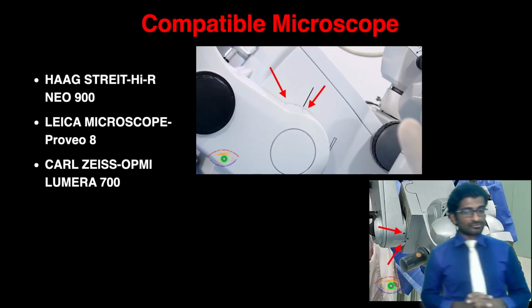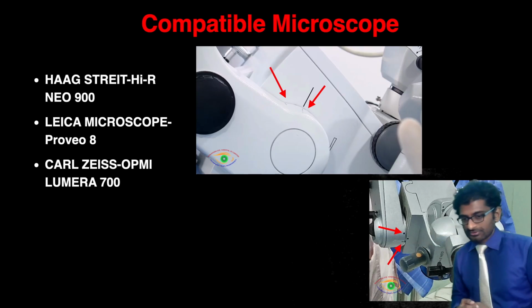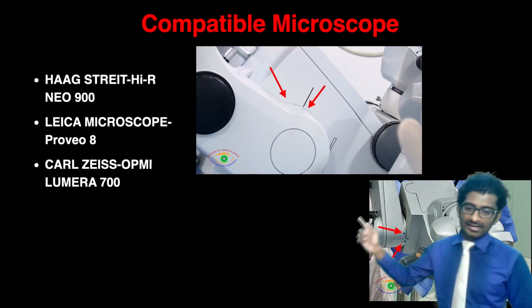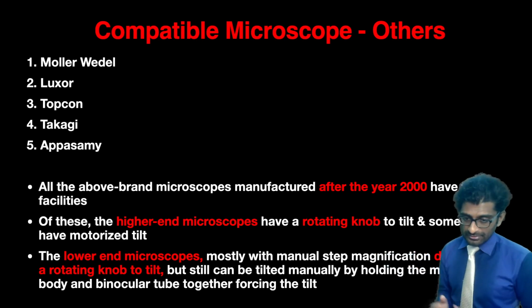And then coming to the microscope compatibility. Of course, your microscope has to be compatible. I personally use these 3 microscopes, Haag-Streit, Leica and Carl Zeiss, but there are other microscopes as well.